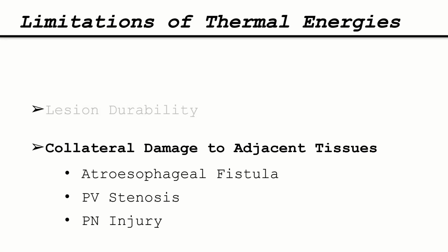Another limitation is, and this is for me the reason why we have nearly completely shifted to PFA in our lab, collateral damage to adjacent tissues. We have to realize that atrial fibrillation ablation is often an elective procedure, if not always. It rarely leads to consequences such as death. So we have to be sure that we're treating the patient with the safest technology we have in our hands, especially with the numbers that we are treating.